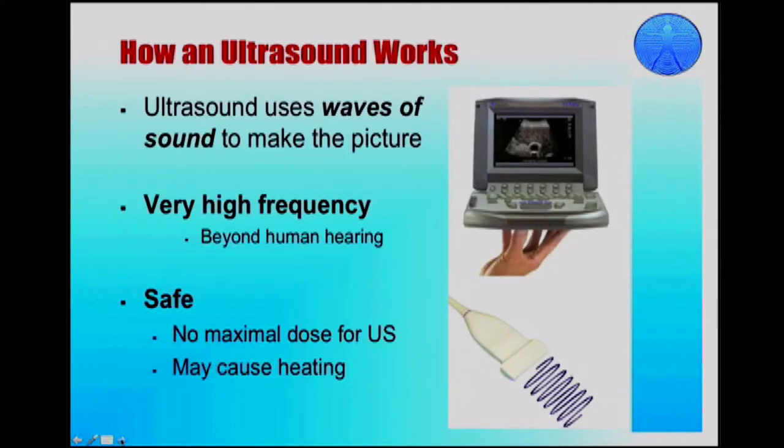So how does ultrasound work? Well, ultrasound uses waves of sound to make a picture. These waves of sound are very high frequency. They're beyond your hearing. And since it uses sound, there's really no maximal dosage for ultrasound, but it may cause tissue heating.